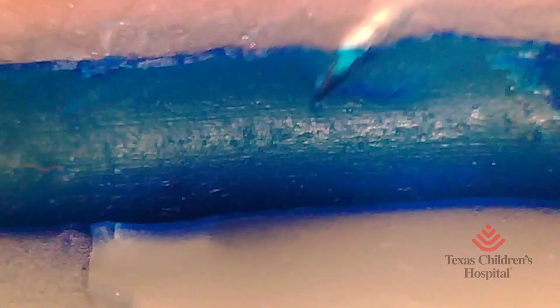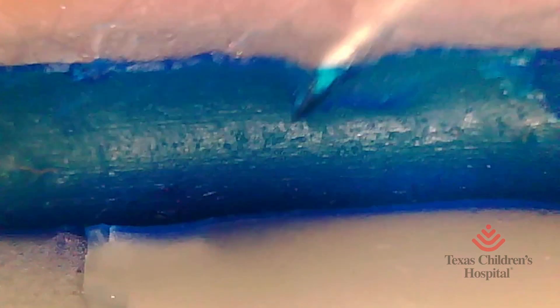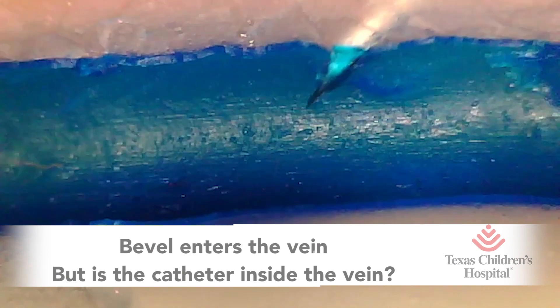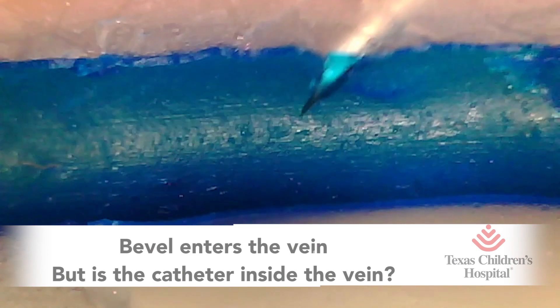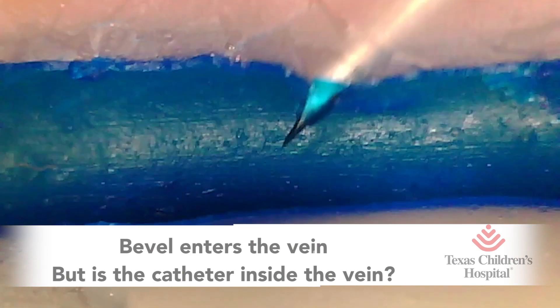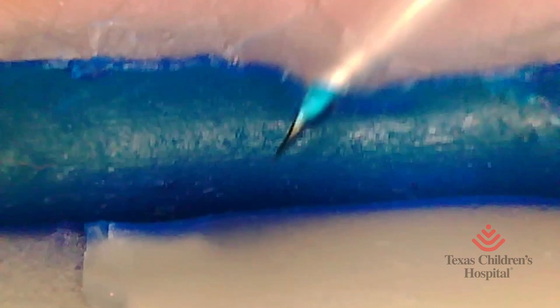Prematurely advancing the catheter will cause another situation where we'll have a blown vein.